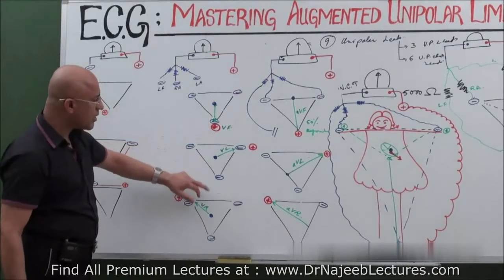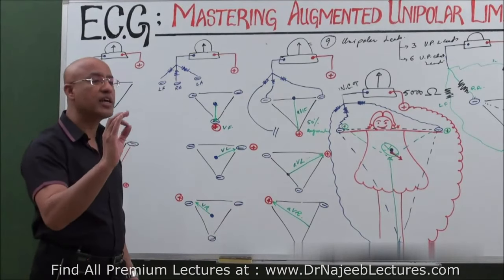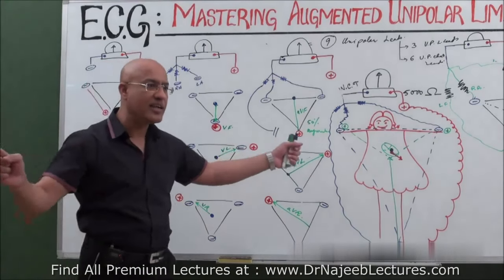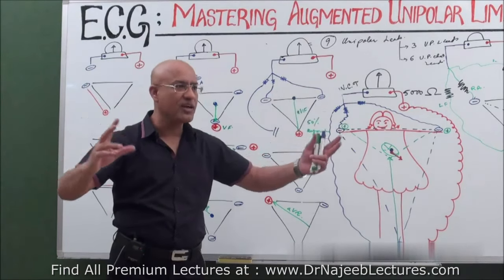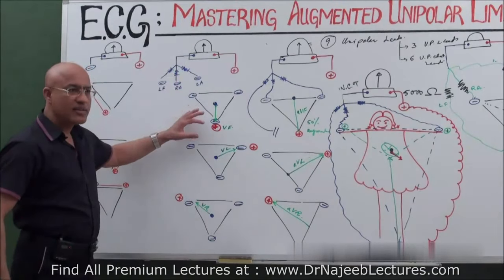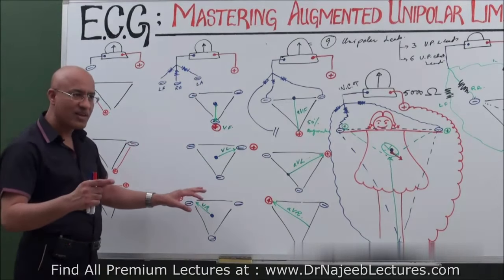Now what is there? The good point of Wilson was that it was able to achieve an indifferent electrode, and it was able to put the indifferent electrode in the center of the heart, and it was able to do it without applying any new electrode on the body. This was the positive thing. The major negative thing about the Wilson system was that the magnitude of the voltages picked up was very small.